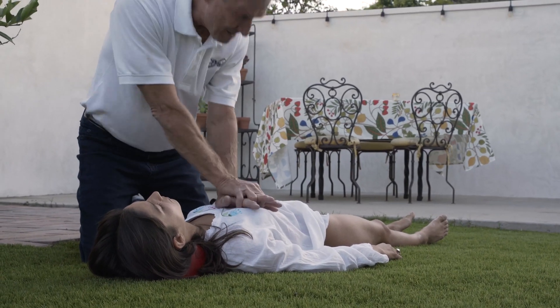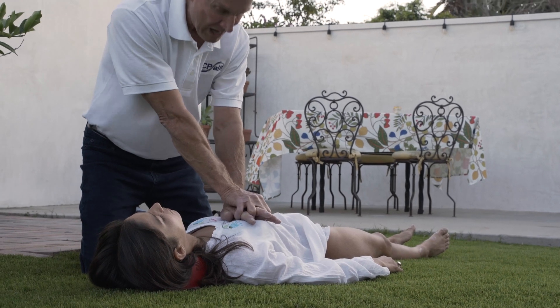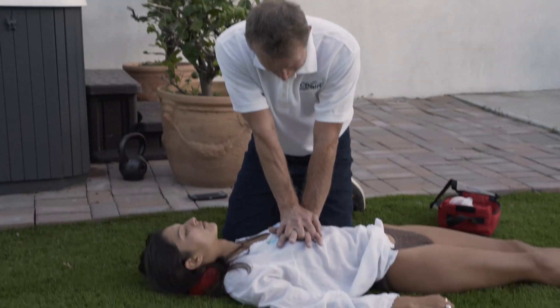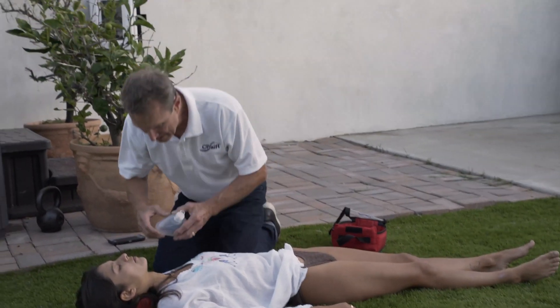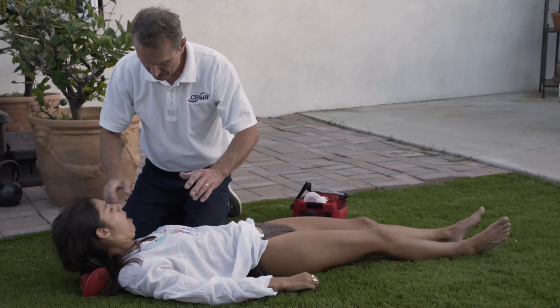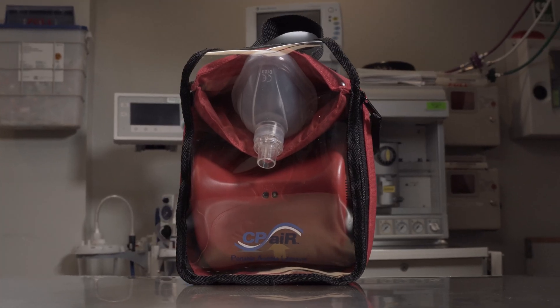Get ready to press. The PAL continues cueing compressions in sequence. Stop. Now if you're able, blow a deep rescue breath through the mouthpiece of the mask, big enough to make the person's chest rise. Let the person's chest fall. These instructions will repeat the sequences over and over until emergency first responders arrive, or you turn the PAL off.